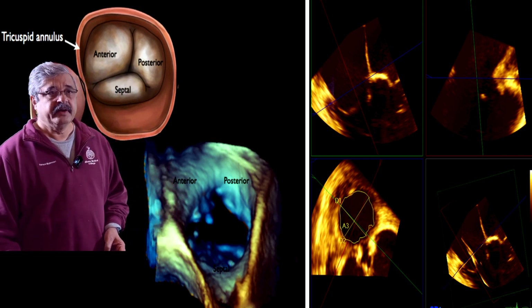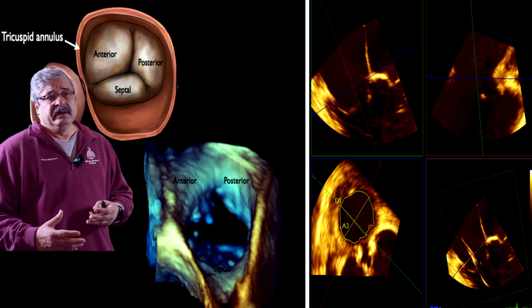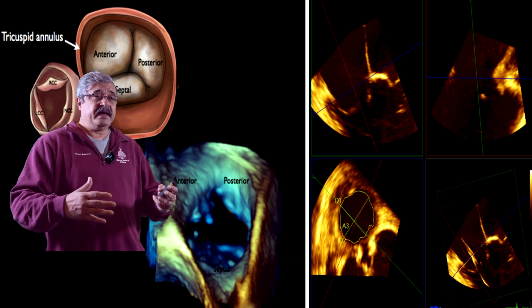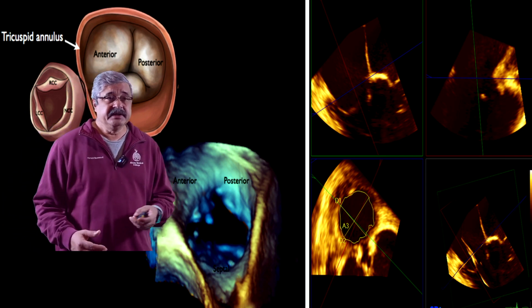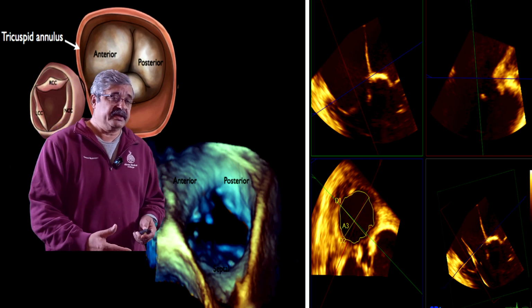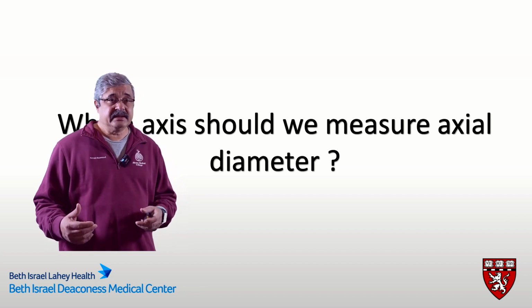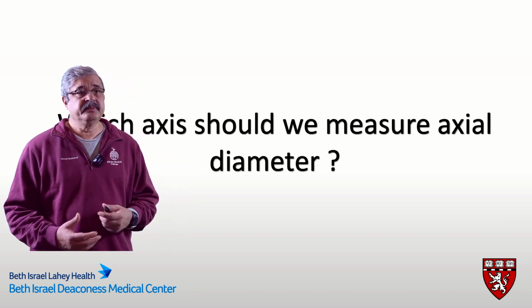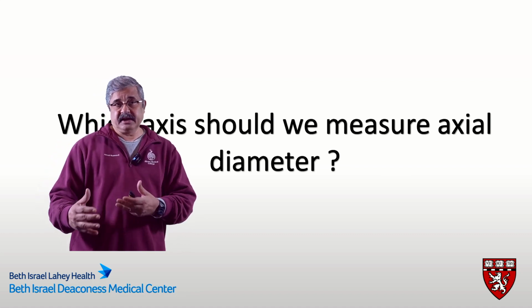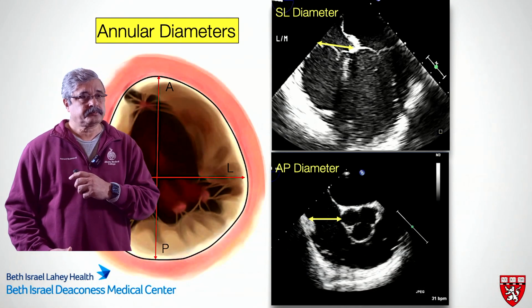same paper where we are looking at the tricuspid annulus and using multiplanar reformatting, and we found that there is no exact axis of its maximal diameter, and it keeps changing, depending on how you look at it, in mid-systole, mid-diastole, and systole and diastole. And so this brings into question which axis or axial diameter should be measured, which represents the true axis of dynamism where the tricuspid annulus predictably dilates. So that's the question to answer.